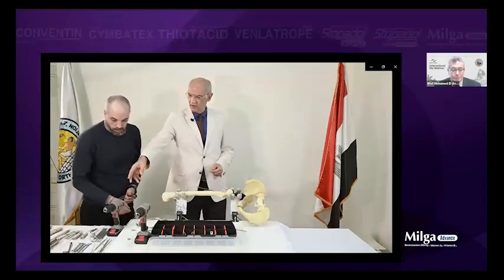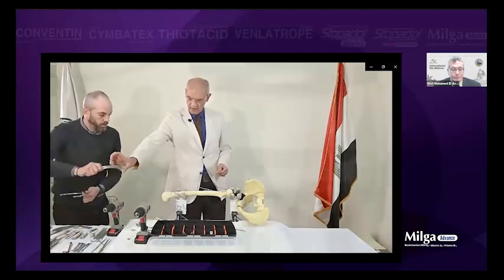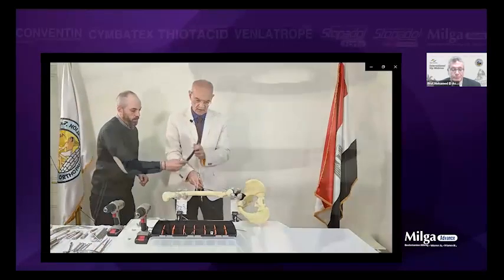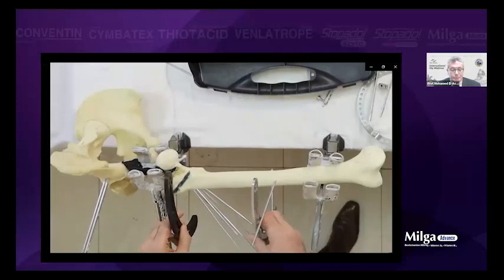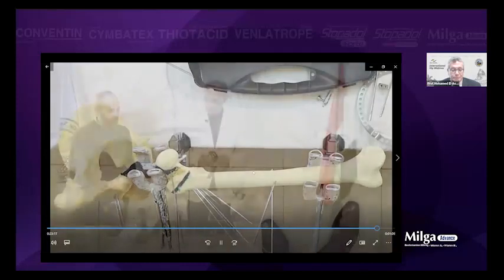For the distal femur, you can use another arch in the proximal femur, you see, and you can fix them together. Give me another arch. See. So you can put it in that direction, and this is that direction, and put the links in between. Or in this direction and that direction, put it in between. You can put another arch in the proximal femur.